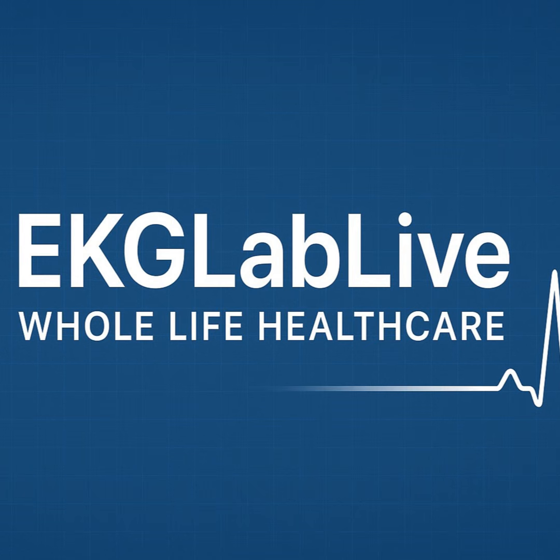So as a clinician watching the screen, you have to ask yourself a sequence of questions. Where is the P wave? Is it positive or negative in the inferior leads? Is it before, inside, or after the QRS? And most importantly, is that relationship consistent from beat to beat? Consistency is your biggest clue. If the retrograde P wave is locked into the exact same position relative to the QRS every single time, you are looking at a driven circuit.